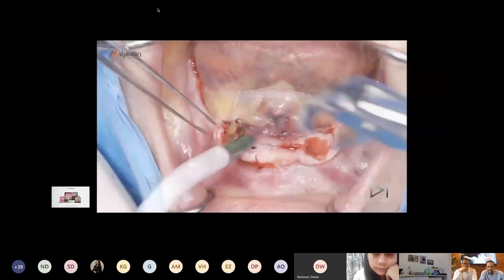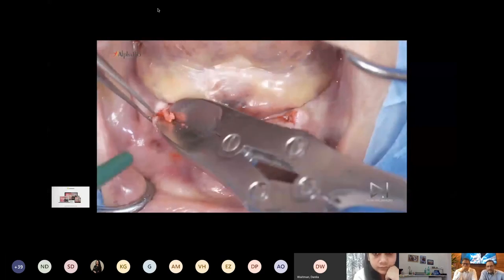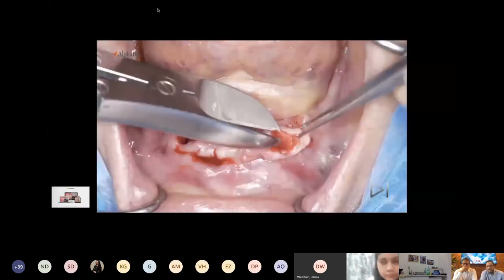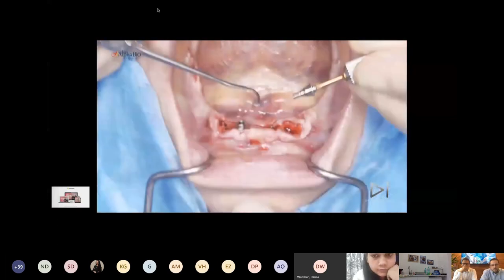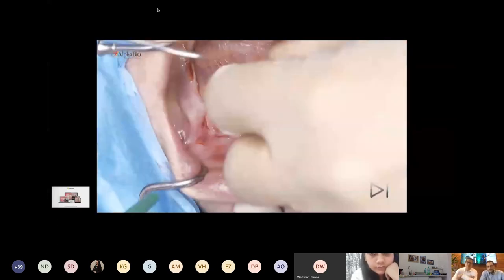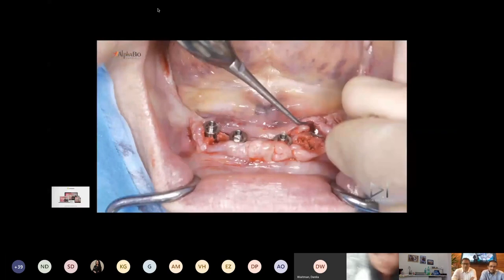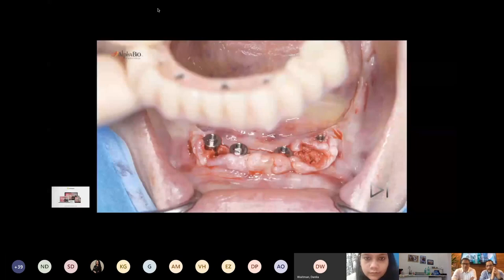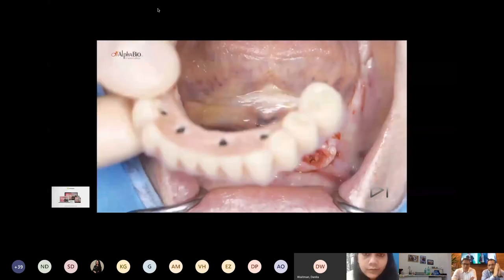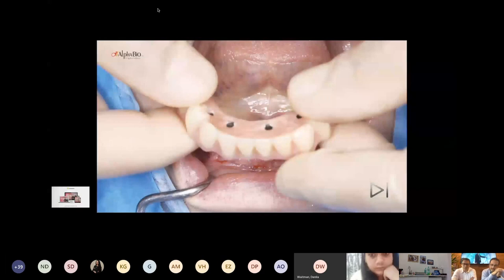All the implants are in the bone. And so we can remove the canine, remove some bony interferences for seating the pre-made prosthesis. This bone will be resorbed. And then we can apply the TCT straight abutment. When it's possible, we love to use four straight parallel implants. And we play with all four if we have the indication for all four.